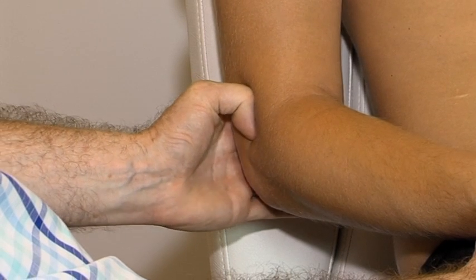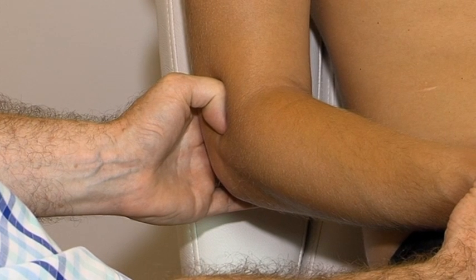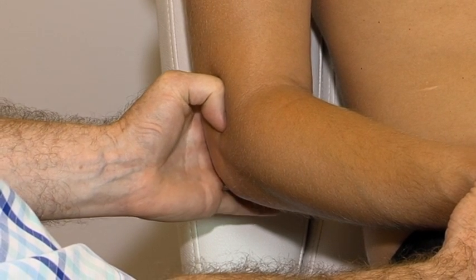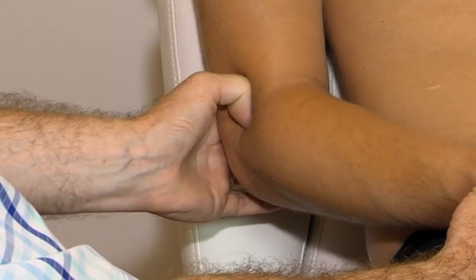The palpation is a translation movement at the front of the lateral epicondyle, with pressure applied in a medial downward direction.